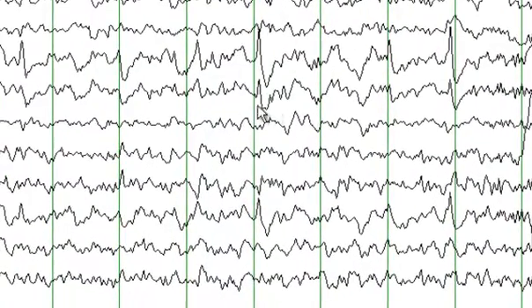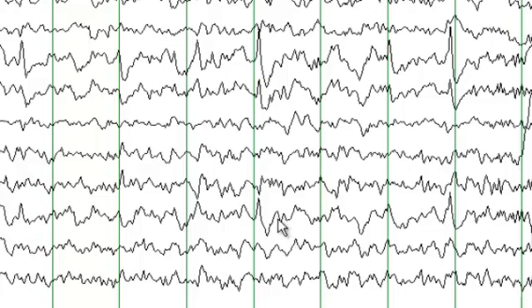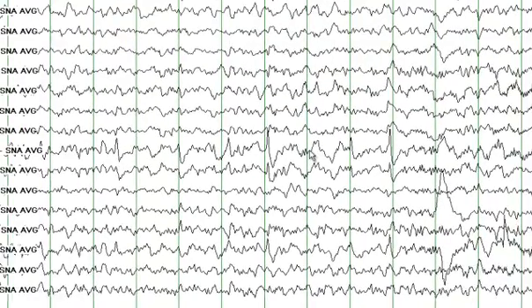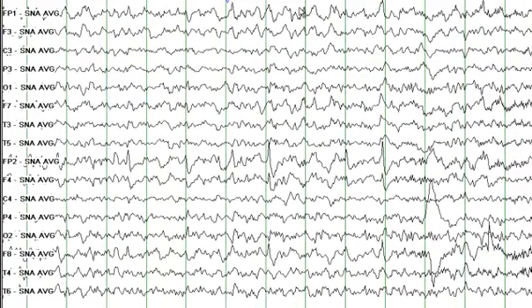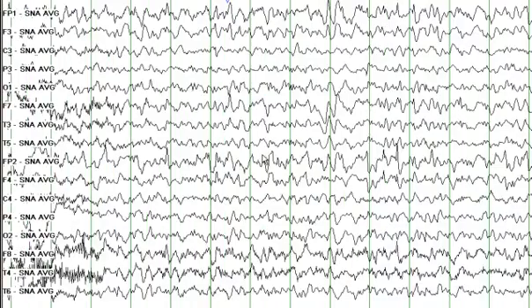Sharp waves — these are what I call juicy spikes. You have a very high amplitude, an aftercoming slow wave, and a nice field with FP2, F4, and F8 involvement. You also note significant slowing in the frontopolar head region, which is seen both on the left hemisphere and the right hemisphere.